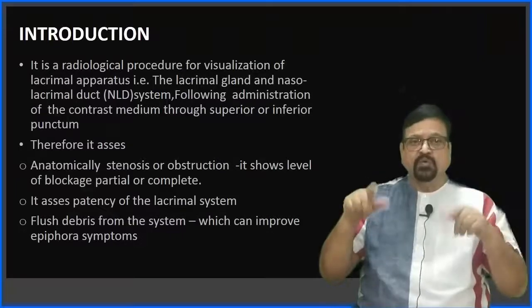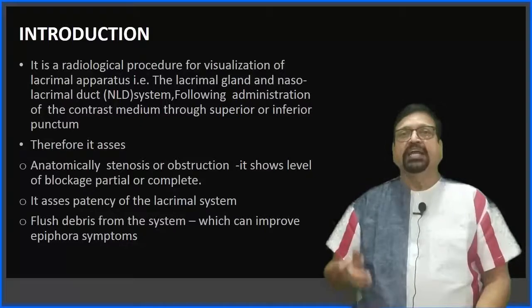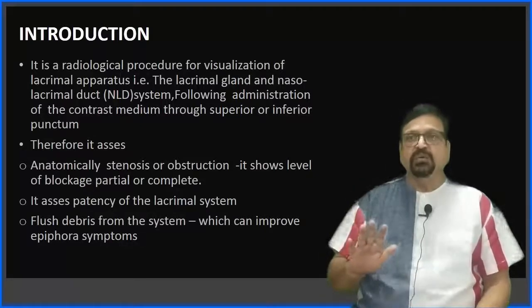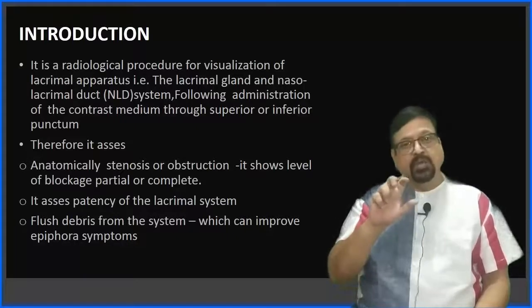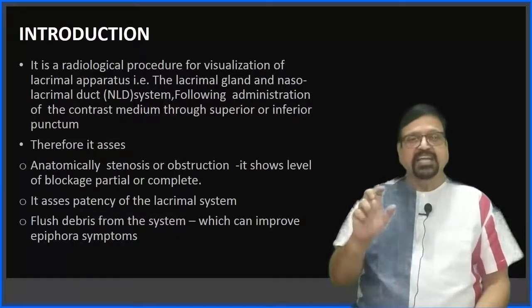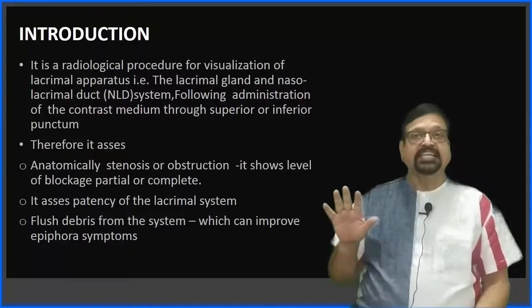Here we go to our lecture. First is introduction. Now it's a radiological procedure, as I told you, for visualization of the lacrimal apparatus. How or where the apparatus is situated, how it functions, how it is to be visualized, all we are going to see in this series.